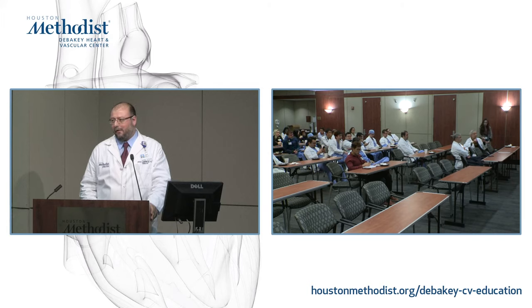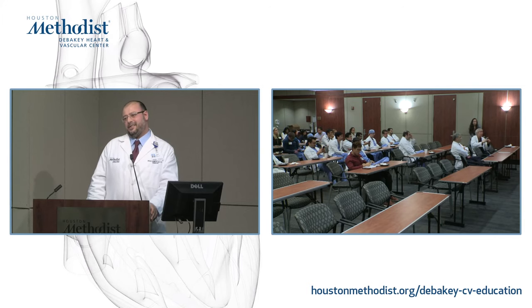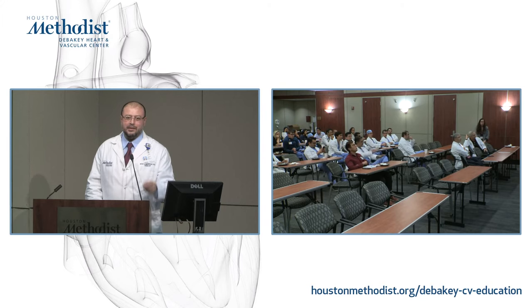I would like to make one other point: there actually is data comparing FFR in the cath lab to rubidium PET, and the correlation is incredibly good compared to angiography, where you're looking at just 50% stenosis or whatever. In fact, it's better than SPECT, and it's better than CTA, because CTA has its own intrinsic problems with overestimating stenosis. Okay, any more questions about instrumentation physics?